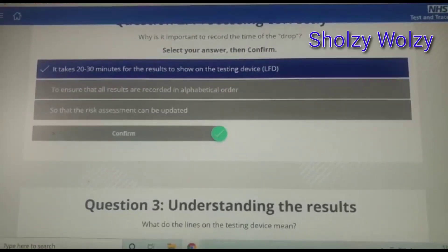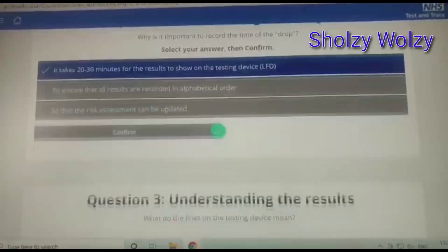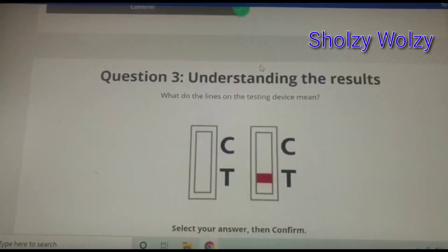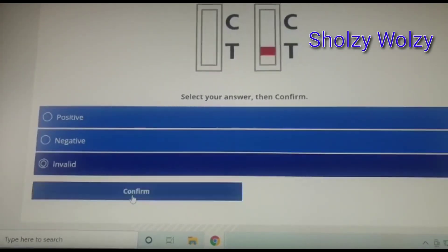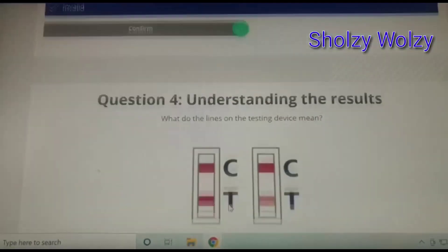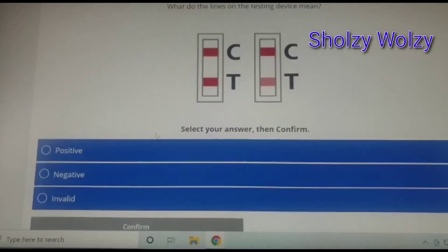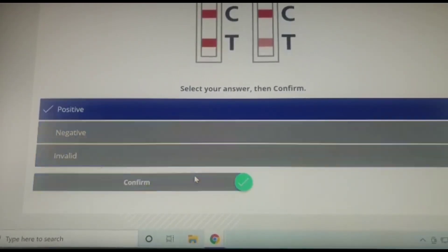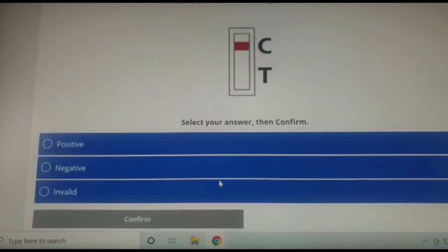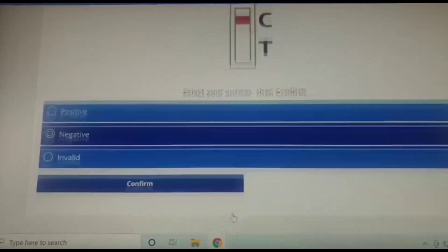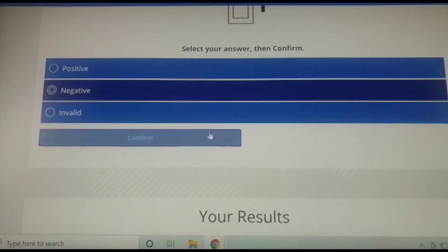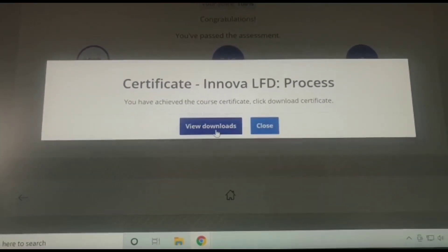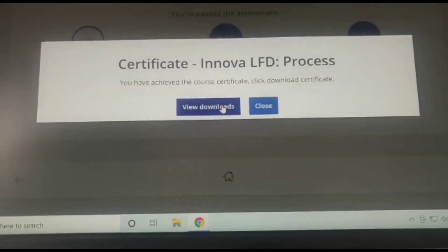I've just clicked my answer for question two, which is correct. Now for question three: what does the line on the testing device mean — invalid? For question four: what does the line on the testing device mean — positive? For question five, the last one: what does the line on the testing device mean — negative?